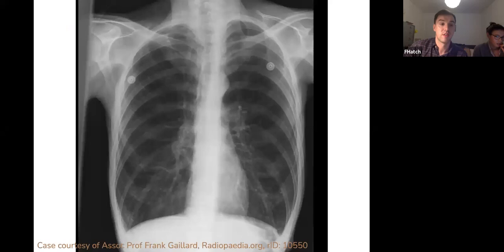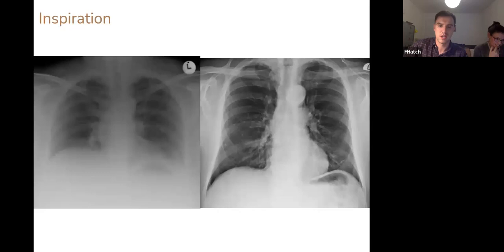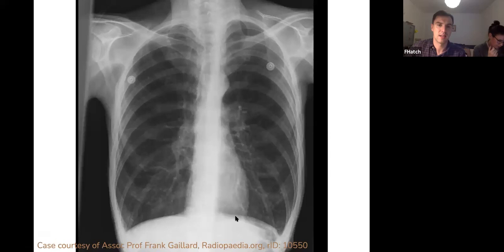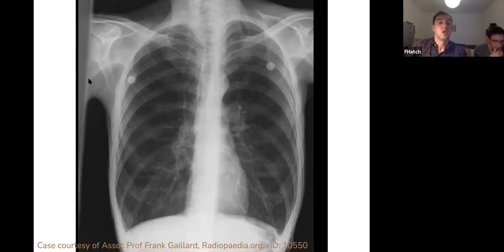Inspiration also helps identify hyperinflation, a feature of COPD and bullous disease. On this x-ray the diaphragms are much flatter than normal — flattening of the hemidiaphragms — and counting reveals more than ten posterior ribs above the diaphragm, consistent with hyperinflation. This is not a technical factor of the film itself, but something you can pick up that gives a clue to underlying disease processes.